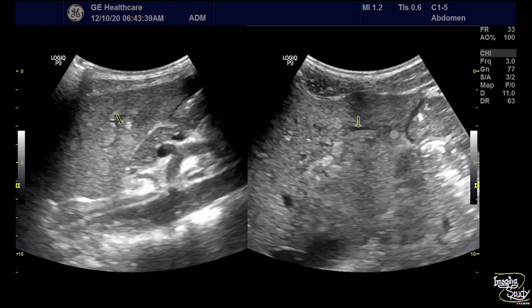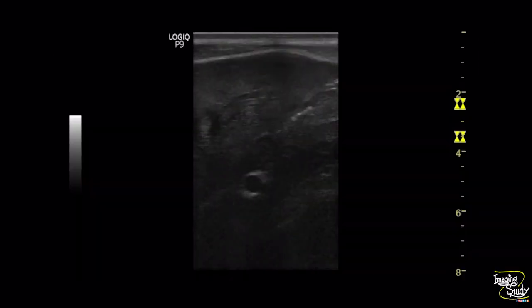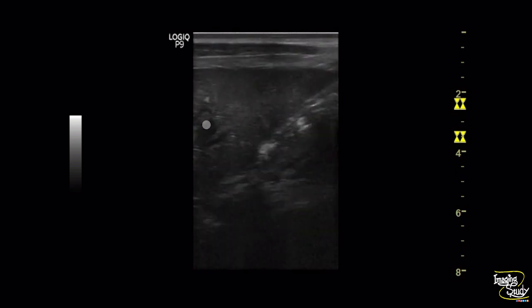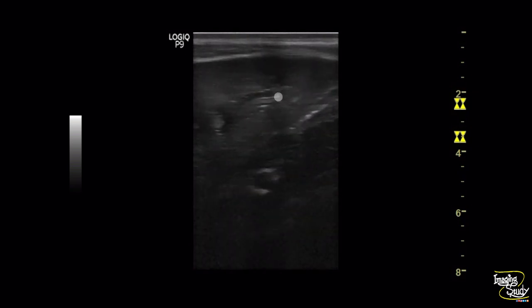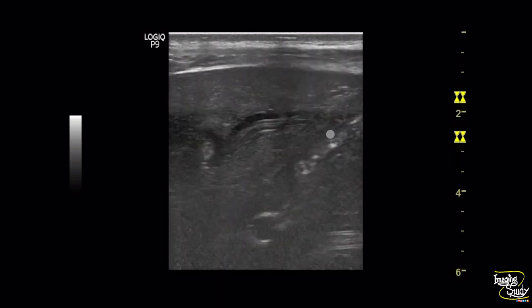I want to show you the high-frequency view of this structure. This is the high-frequency linear transducer view and you can see the worm with surrounding hypoechoic wall thickening in this view.